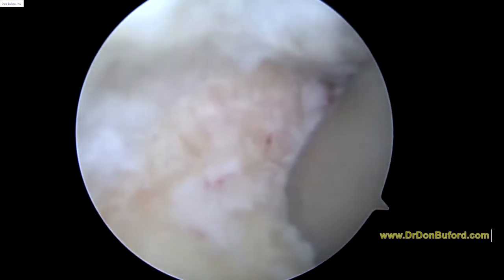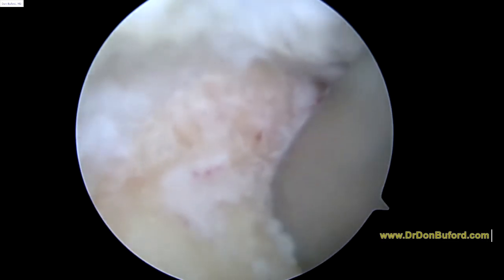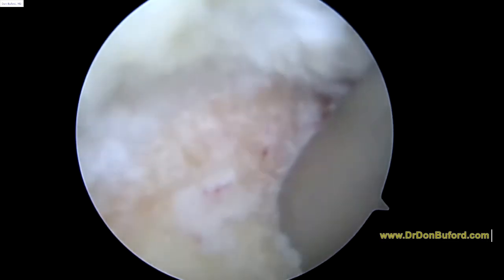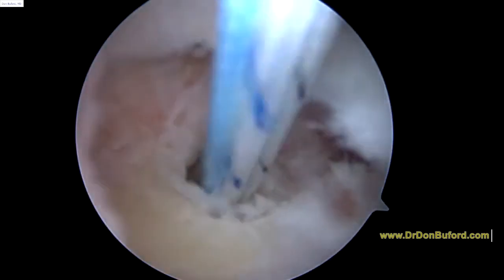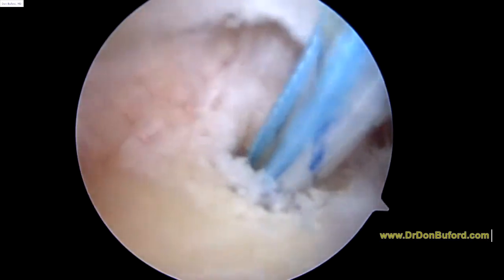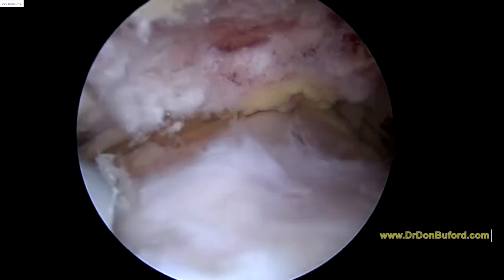So that's where we are. Once the anchor is in, it's important to seat the anchor by pulling back. So that's what we just did. That locks the anchor into the bone, and that is now very secure. So let me get back up into the space here.